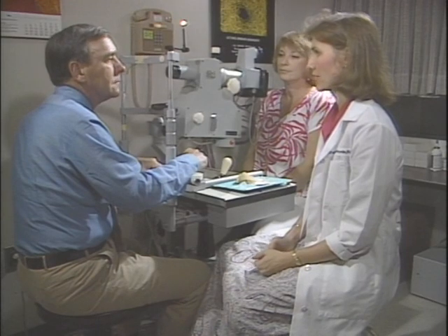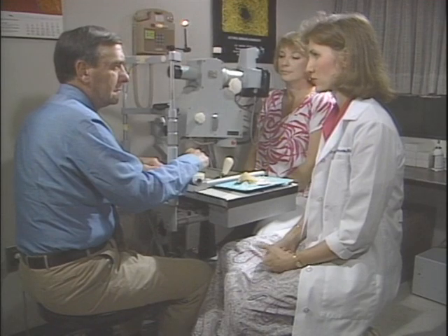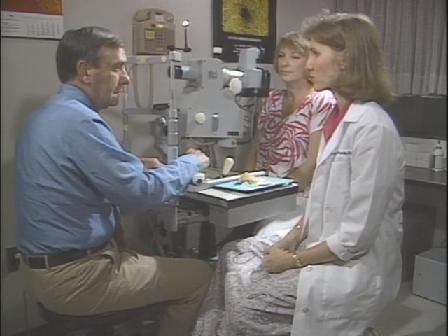You may feel a mild sensation of nausea. If you have even the slightest bit of nausea, tell your physician or the photographer. You will be allowed to rest for a moment. You will be instructed to sit as still as possible for a few moments after the injection to allow the dye to pass through the blood vessels in the back of the eye. Have you had any reactions to any medications or any dyes before this test?